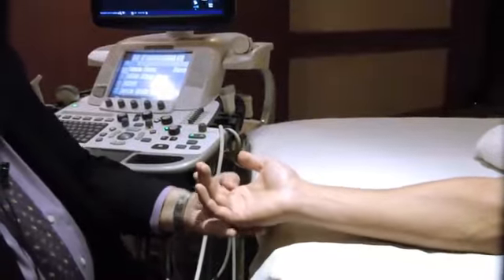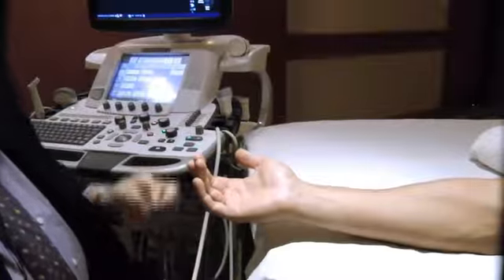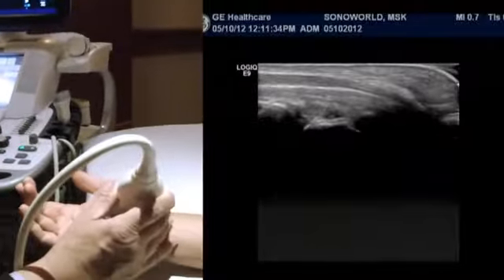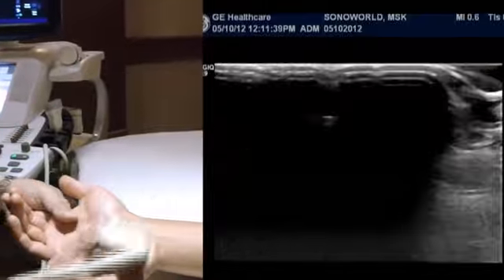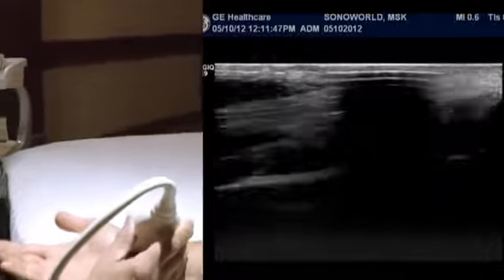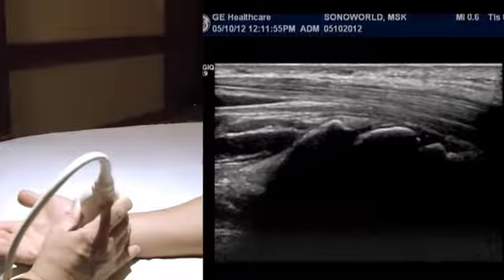We begin by looking at the area that is most commonly affected by taking a look at the carpal tunnel. We're going to identify the median nerve in the long axis view by looking at three bones. Your bone acoustic landmarks are going to be the radius, lunate, and capitate. We're going to ask Mike, our model, to put his hand flat on the table, and we're going to take a peek again at the bone acoustic landmark of the radius, lunate, and the peanut-shaped capitate.